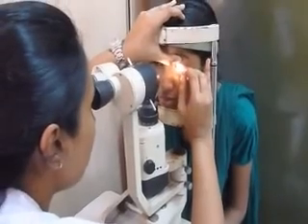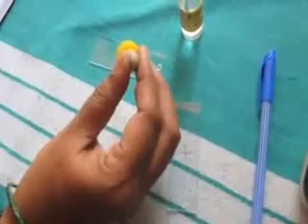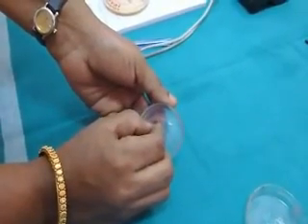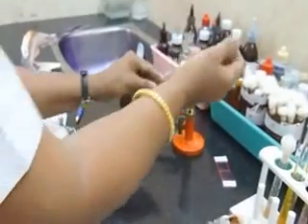For identifying Acanthamoebae, scrapings were taken from the active edge and base of corneal ulcers and examined under wet mounts with normal saline and or 10% potassium hydroxide. For isolation of this parasite, non-nutrient agar with E. coli overlay was used.